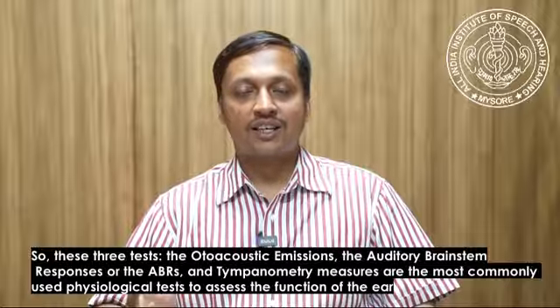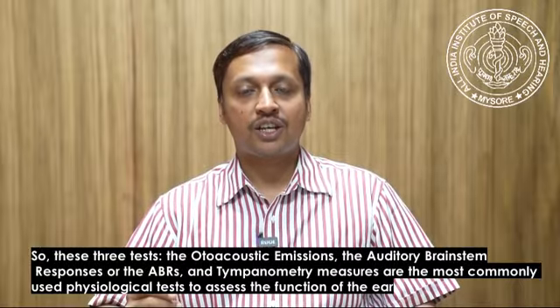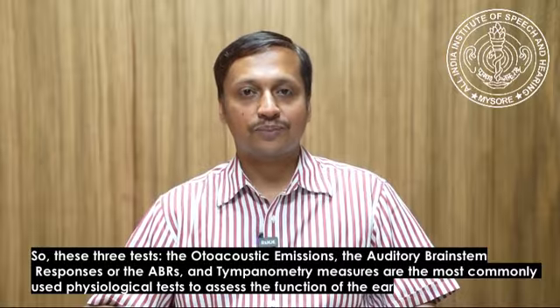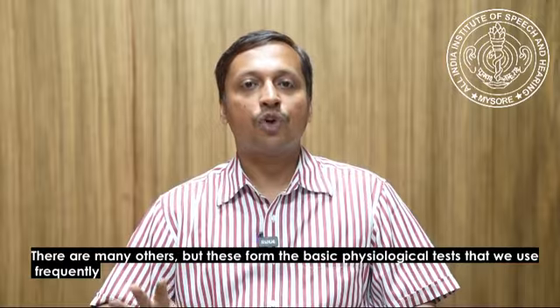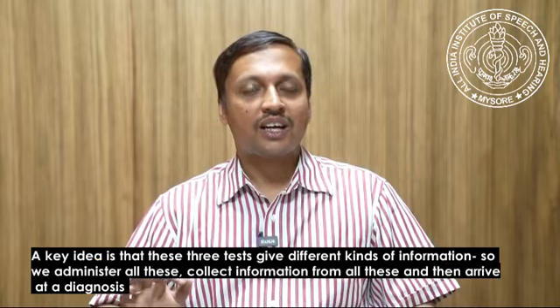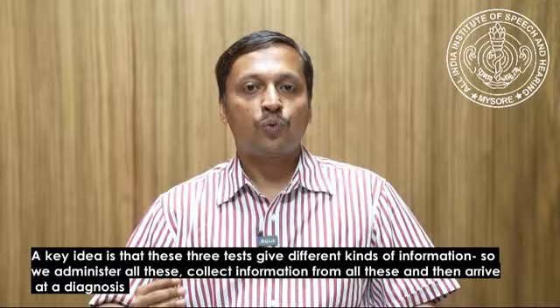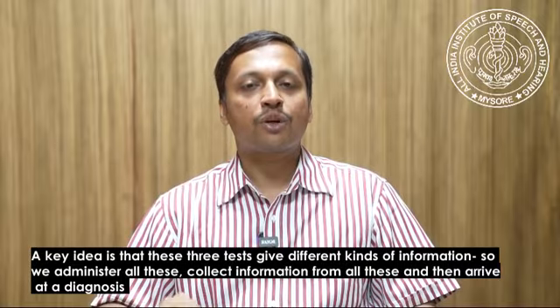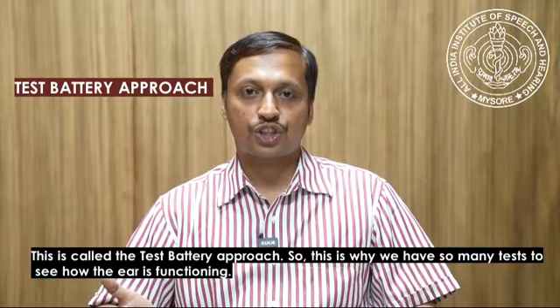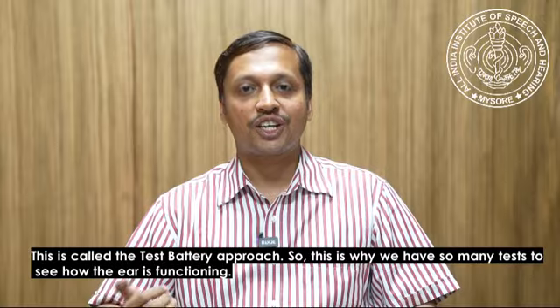So, these three tests, the otoacoustic emissions, the auditory brainstem responses and tympanometry measures are the most commonly used physiological tests to assess the function of the ear. There are many others, but these form the basic physiological tests that we use frequently. A key idea is that these three tests give different kinds of information. So, we administer all these, collect information from all these and then arrive at a diagnosis. This is called the test battery approach. This is why we have so many tests to see how the ear is functioning.